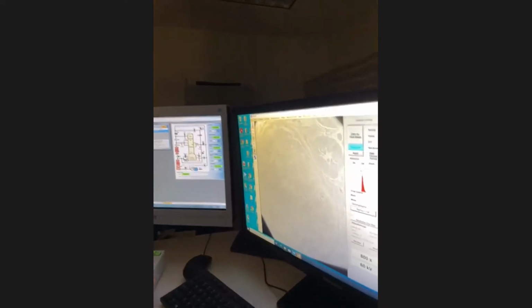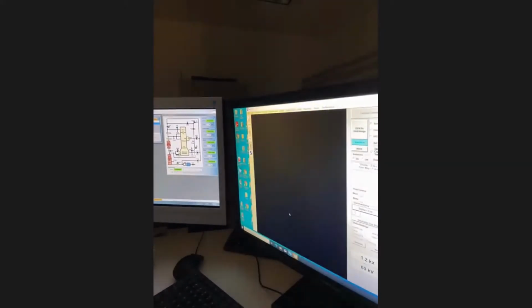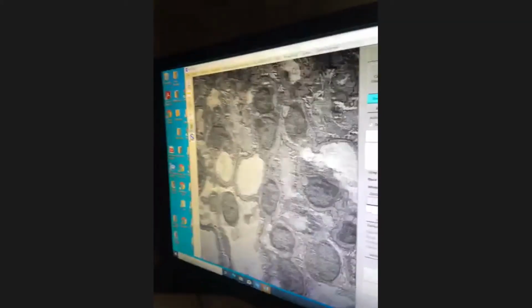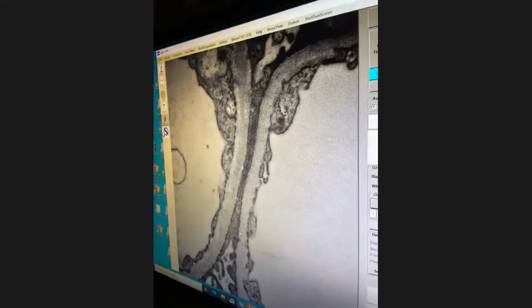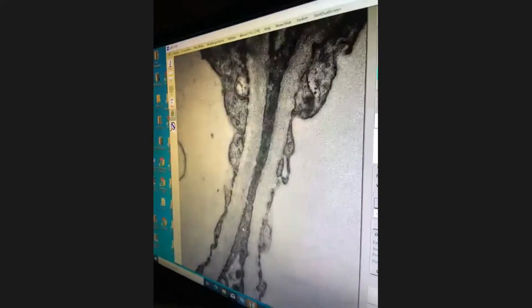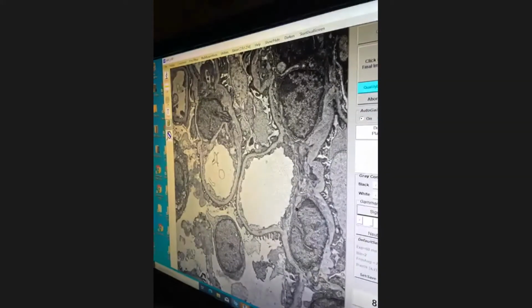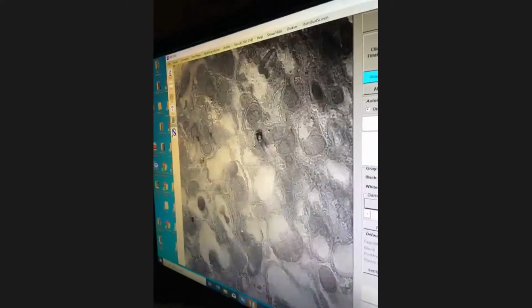Jamie, what magnification are you at? Right now I'm at 800, but to help with doctors' diagnosis, we might zoom in and get a close up on these loops here. So this is at 15,000 times the magnification of the original 10. And you can zoom in even further than that. Getting up close can allow the doctors to make their proper diagnosis, and we keep in mind and look for abnormalities that can also aid in whatever it is that they are looking for.